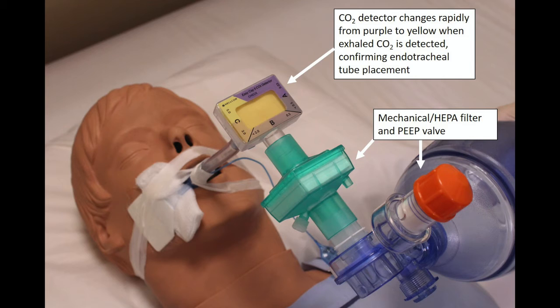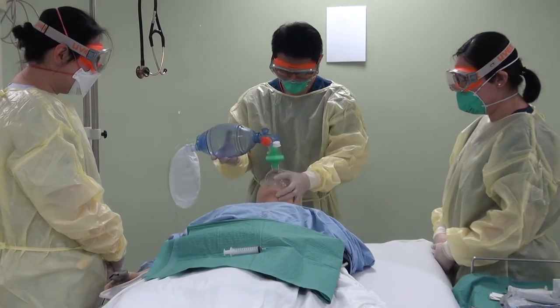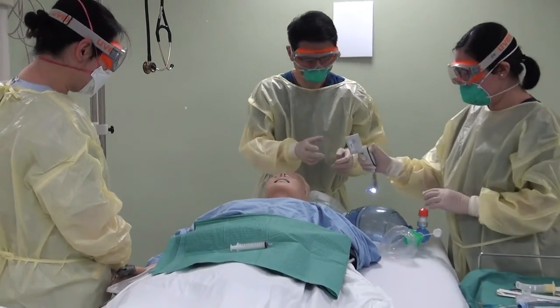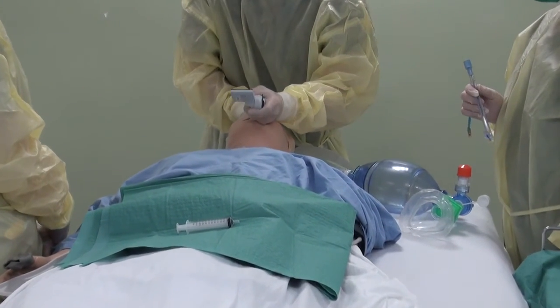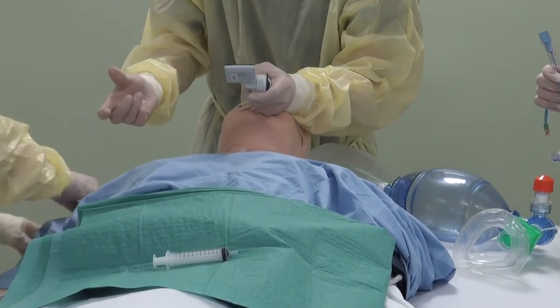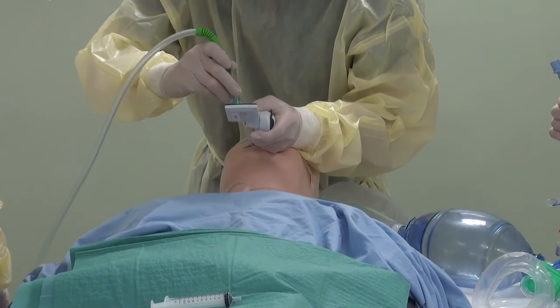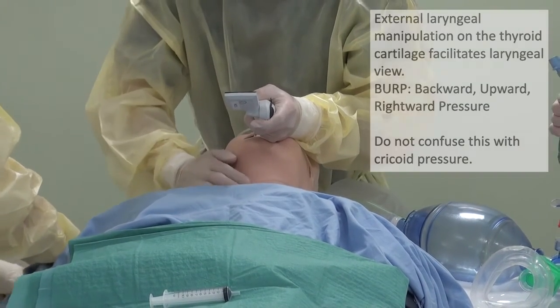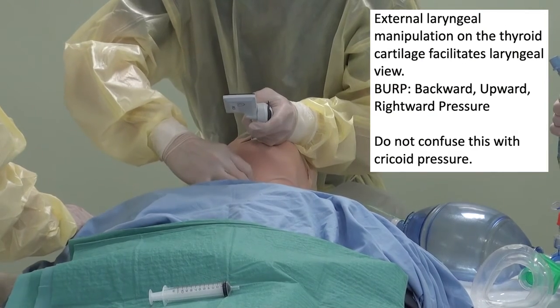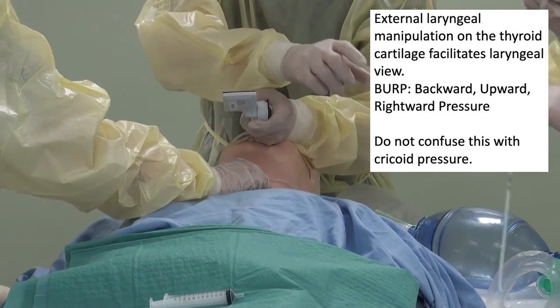Notice that the filter continues to be used here and it is important in patients with suspected or confirmed COVID-19. Here we are illustrating a scenario where the team encounters difficulty with intubation. One example can be secretions or blood in the pharyngeal space which can obstruct view of the vocal cords, and this emphasizes the need to have suctioning equipment readily available. Occasionally, visualization of the vocal cords may be difficult with a direct laryngoscope, less likely so with a video laryngoscope. Nevertheless, external laryngeal manipulation can be applied by displacing the thyroid cartilage in the backward, upward and rightward direction to improve your view.